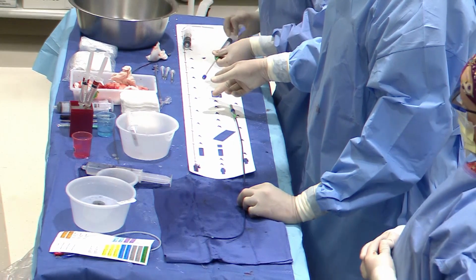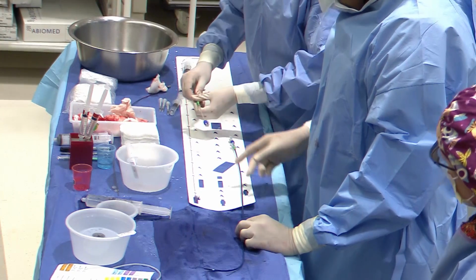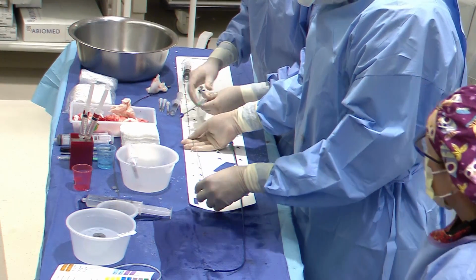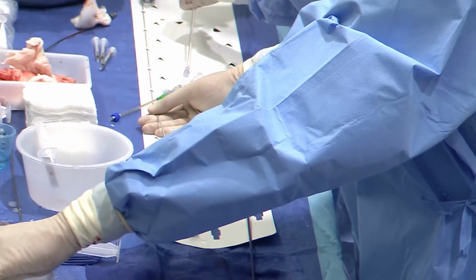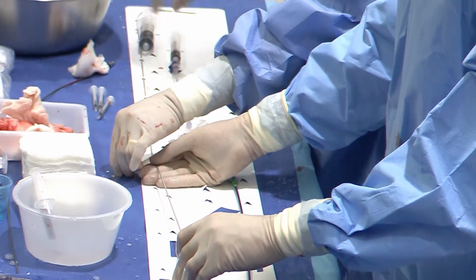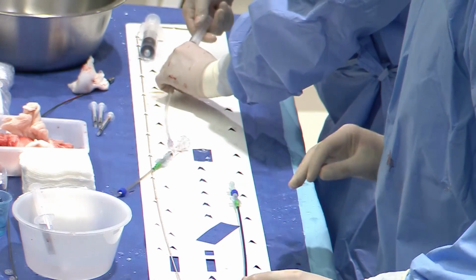This is the loader, and we're going to flush the loader and connect the valve to it. And this is the tether that's going to be connected to the device. This is a 16 millimeter Amplatzer occluder that we're going to connect to the device and load inside the loader, which is then going to go through this sheath.